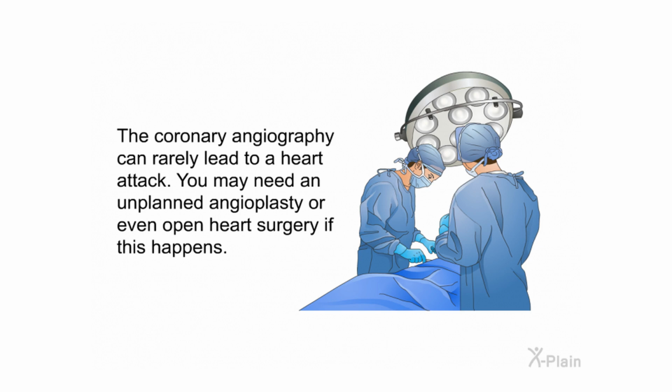The coronary angiography can rarely lead to a heart attack. You may need an unplanned angioplasty or even open heart surgery if this happens.